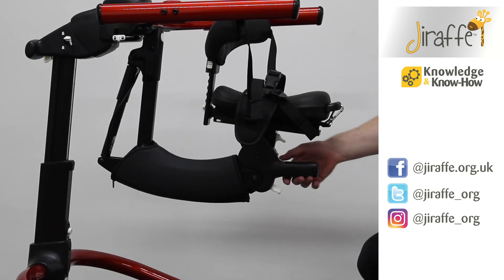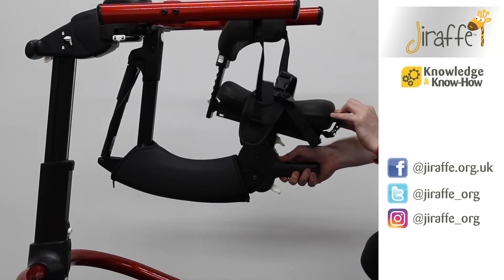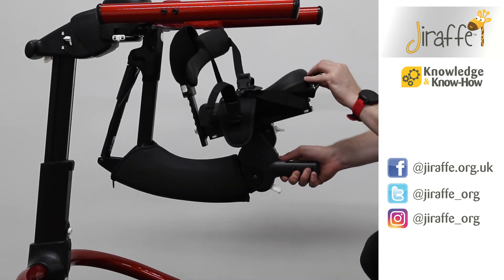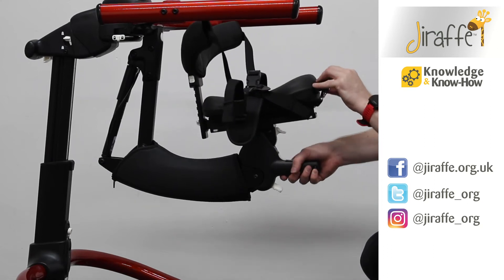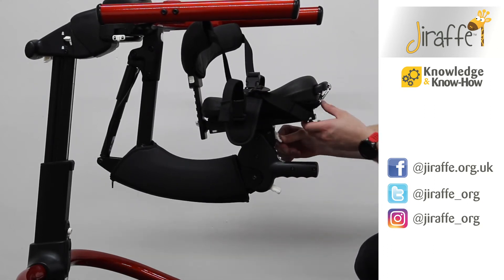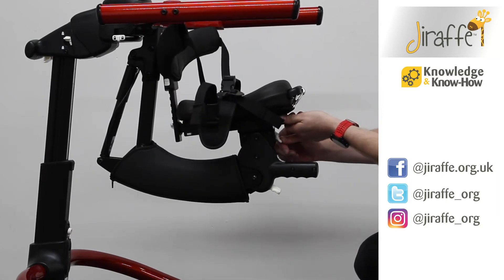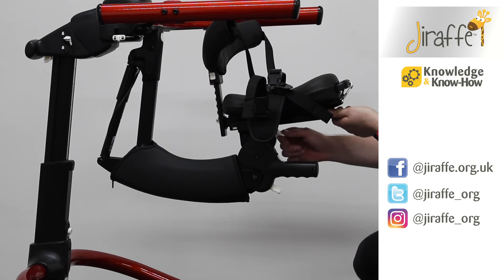The next white button just here — if we press this one down, you can see that we can angle adjust the saddle front and back. And then a third button here at the top will allow us to move the saddle to the front of the frame and to the back of the frame.